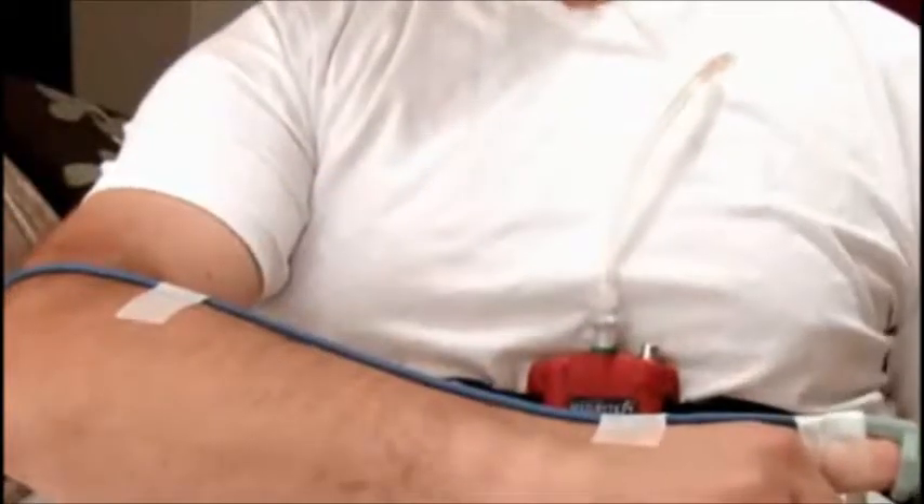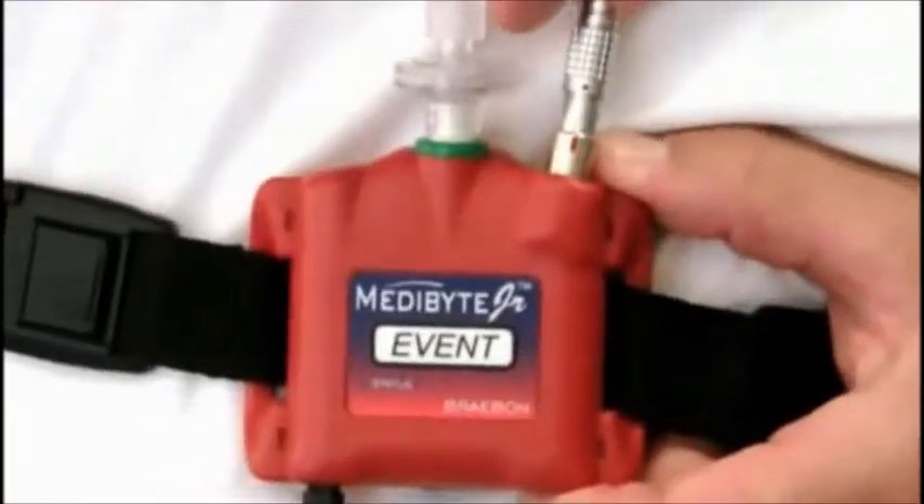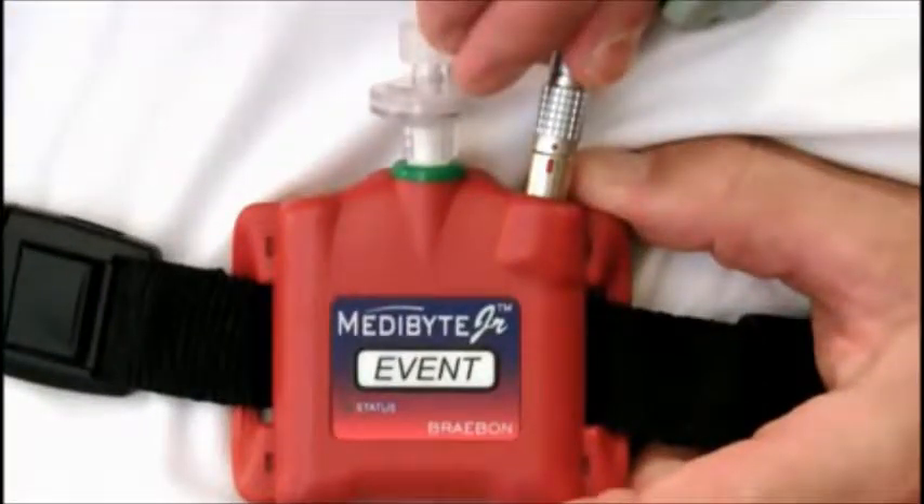Next, secure the cable up your arm with additional tape. Now you can plug the other end of the sensor into the SPO2 port on the unit.